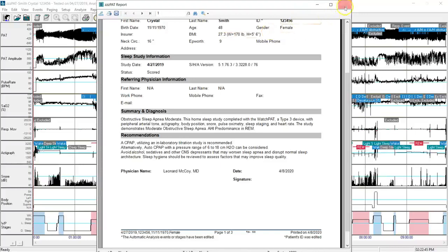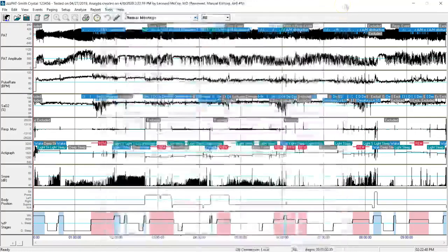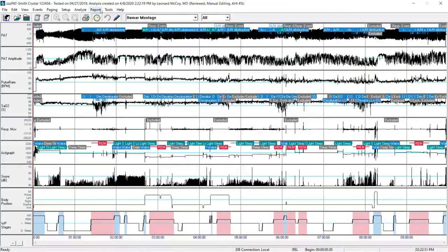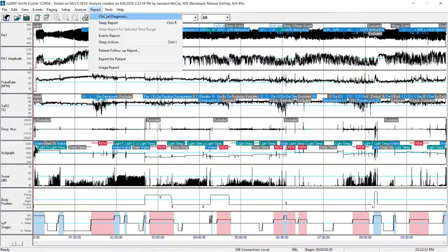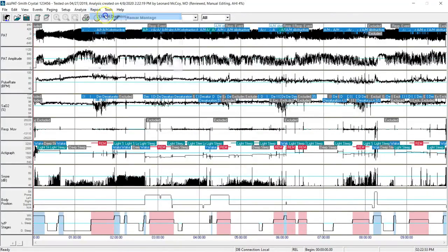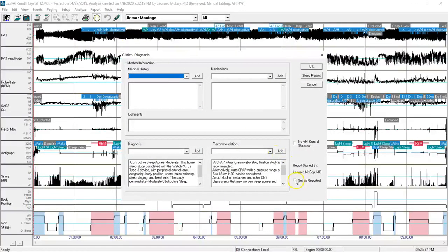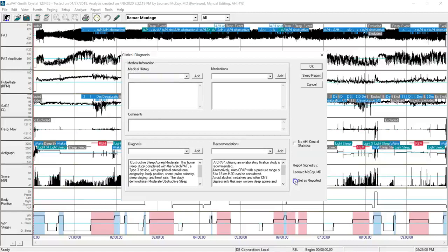If I'm satisfied with that, I can close the file, go back to report up at the top, click on clinical diagnosis once again. I'm satisfied with that report, and I can now click on set as reported and click on OK.